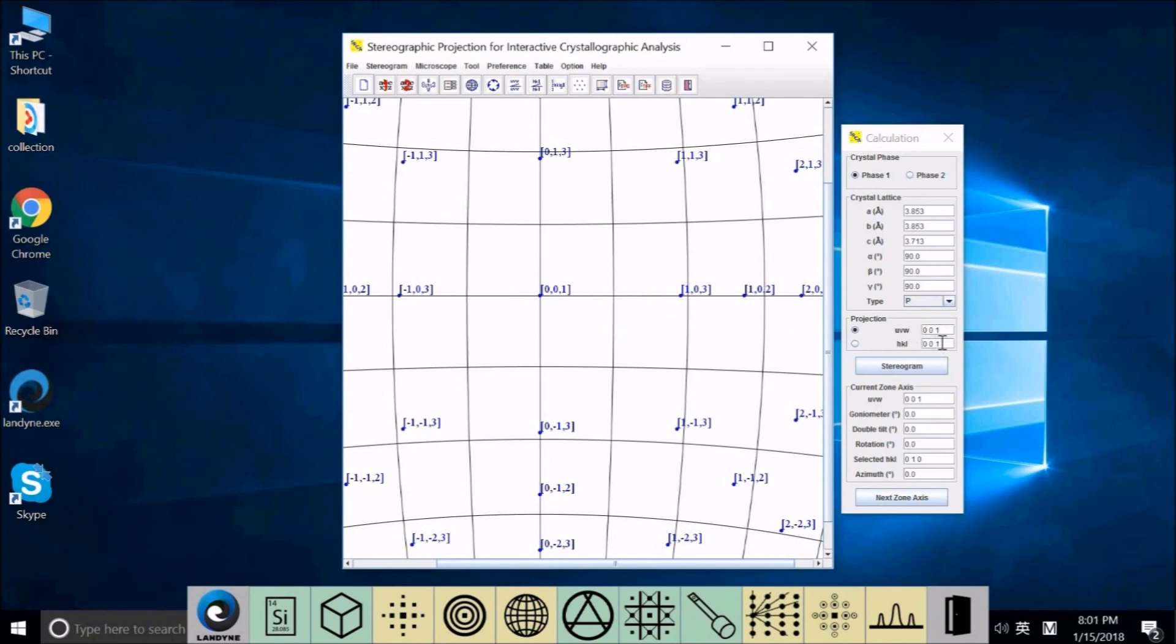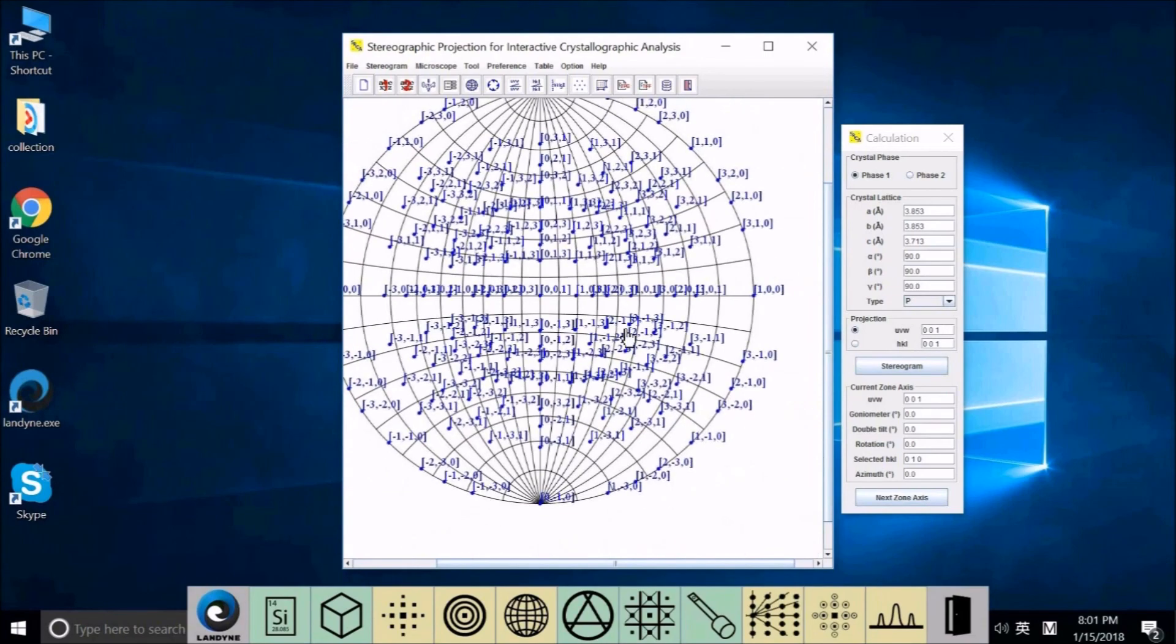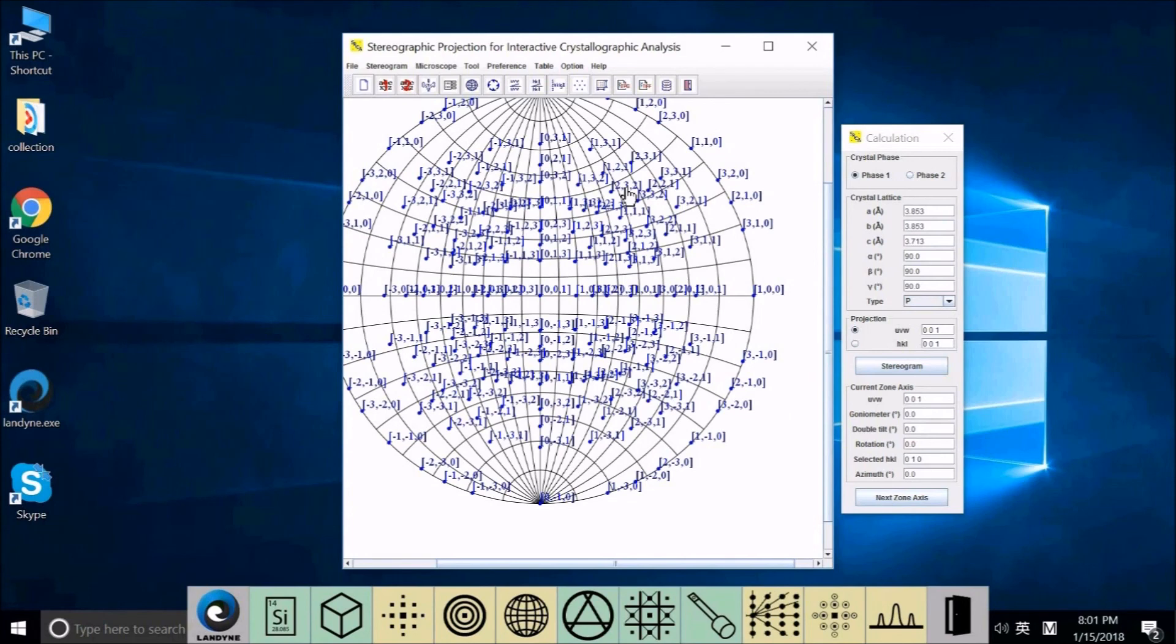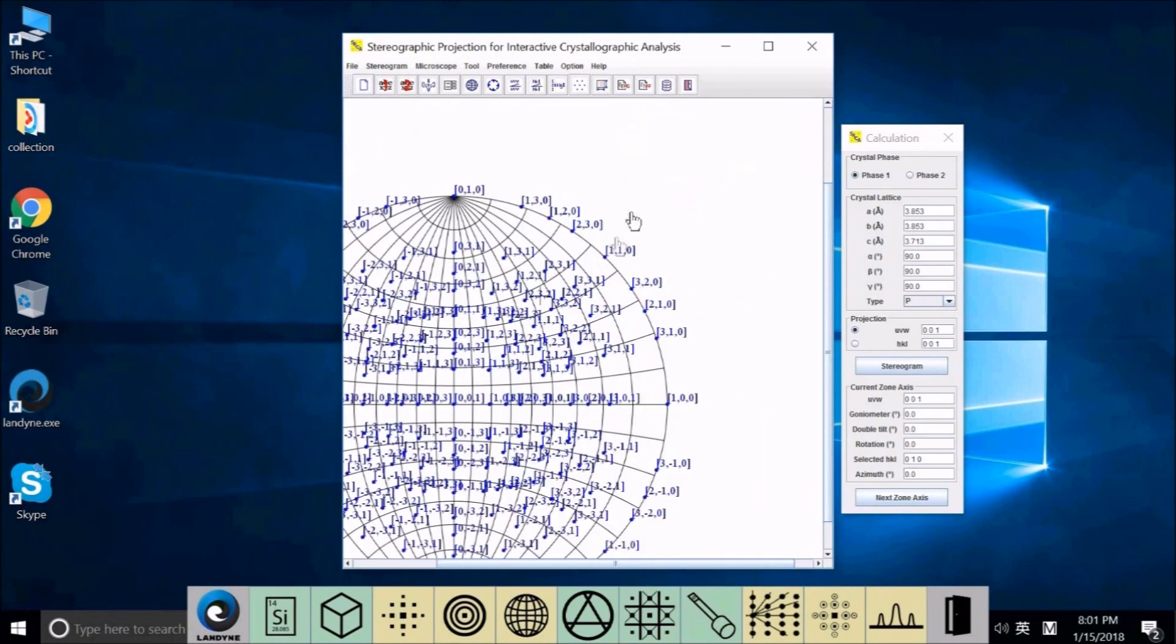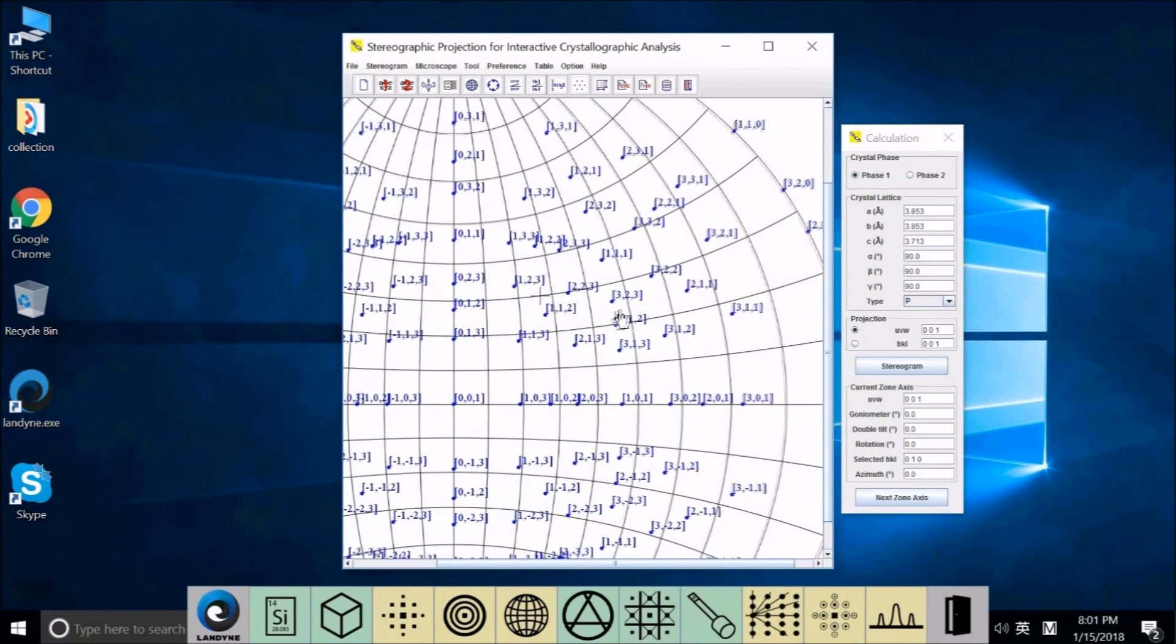If you want to move an HKL to the center, hold the Control key and you see a cross there. Hit the left button and so you have the center moved. Then you can enlarge the view. You can make small adjustments with the Control key to precisely position zone axes in the center.